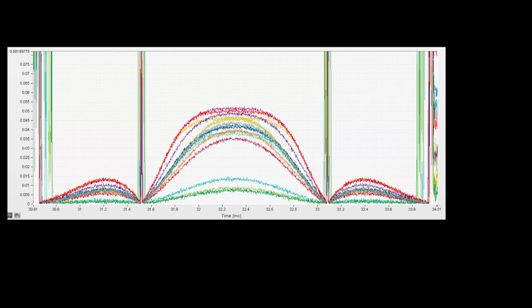And this was one of the challenges of porting everything from an old scanner to a new scanner. We had to reprogram our whole 3D EPI sequence on the new scanner. And we realized that the ways that we were trying to zero out the voltages were not completely taking care of the problem. So we actually had to zero out each of the pulses individually. And you can see the pulse envelope of the 180-degree pulse here.